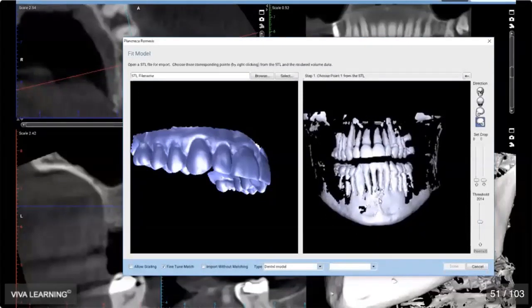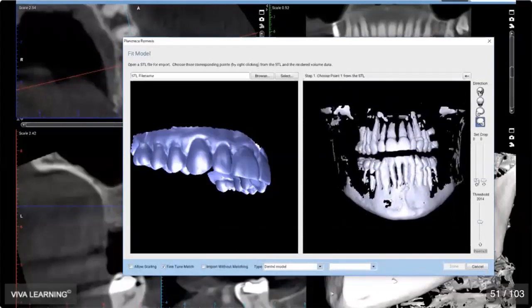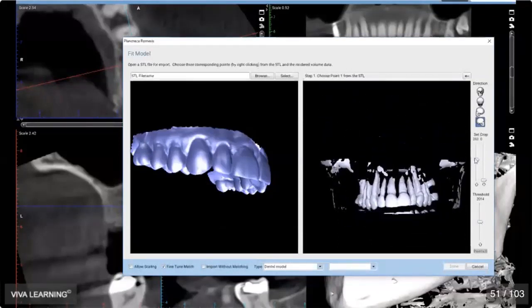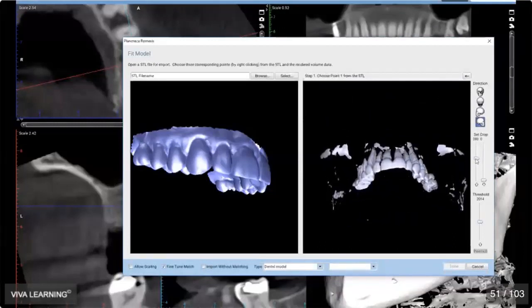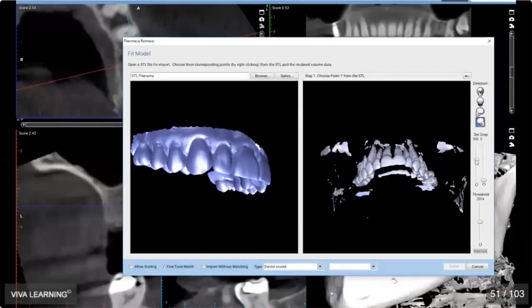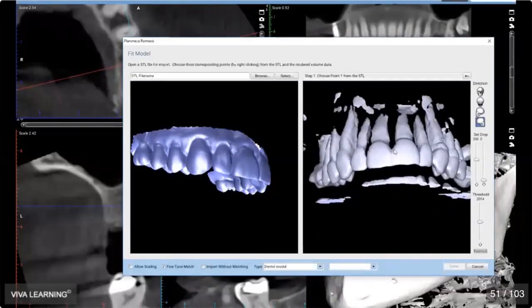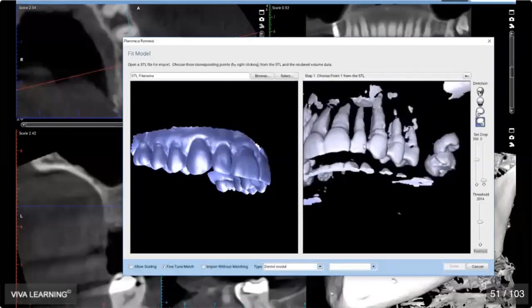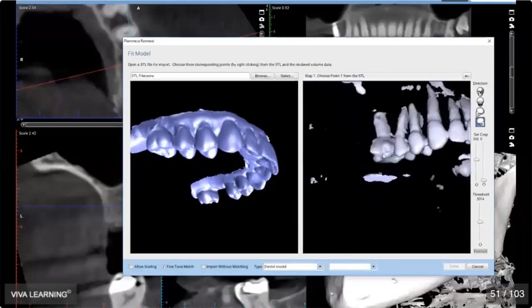The enamel or restorative aspects of the teeth are so dense. And you're looking for common data points between hard tissue. So the only thing we have really are the parts that stick out of the gums into the mouth. So the clinical crowns of teeth are those aspects that we need to use to merge our intraoral scan data with our CT scan. So, we can do things like section the arch a little bit. We can play with the threshold.